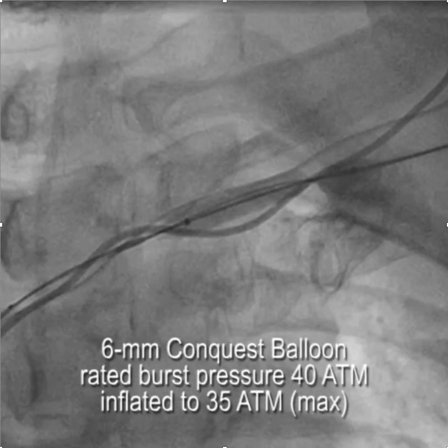Ordinarily when a balloon bursts that doesn't cause any problems, but in this case the distal part of the balloon didn't want to come out — though that's a different topic. This is the first time I've ever had the bursting of the balloon cause any issues. It didn't cause any vascular issues; it just meant that the balloons were sort of stuck.